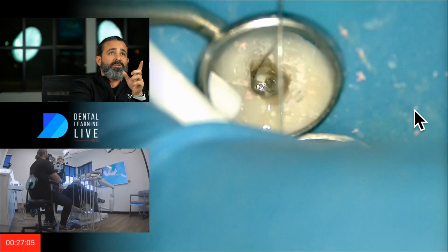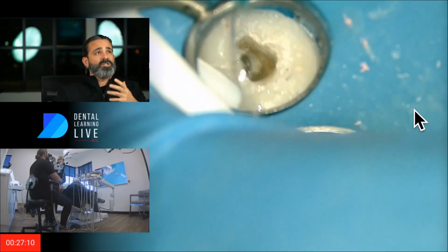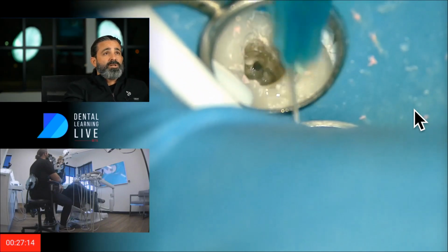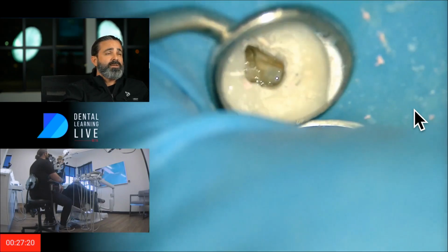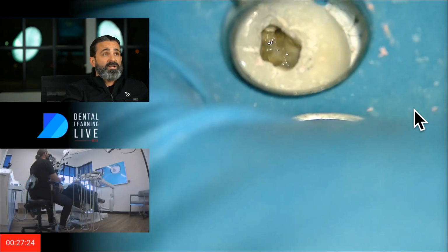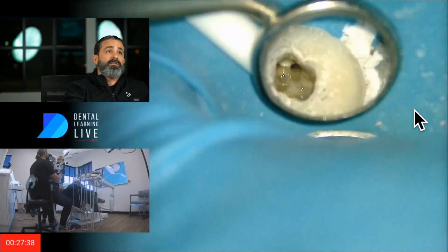And this is very, very important because I'm on the MB1 and MB2, and there again, just to remind you, that's where the lesion is. And so that's the thought process. And I'm just sort of self-validating with stories in my head as I'm working to make sure I stay engaged and stay focused and do the job that I was getting paid to do. And in this case right now, it's remove all that gutta percha. But tedious for sure.